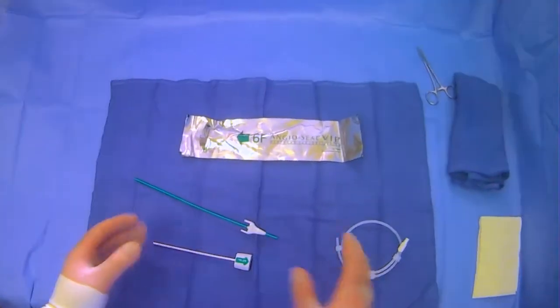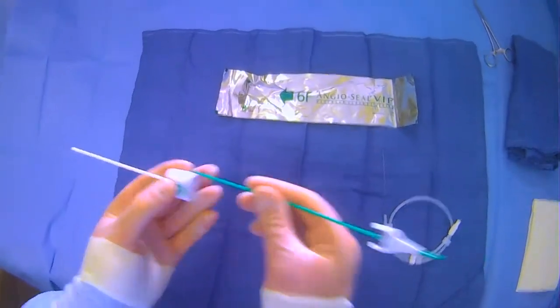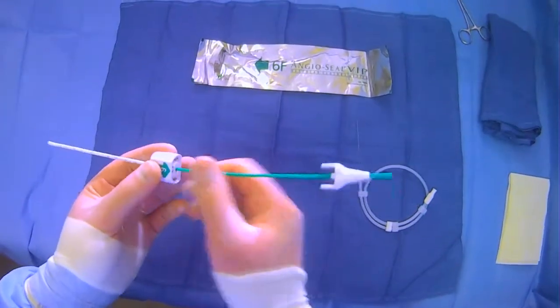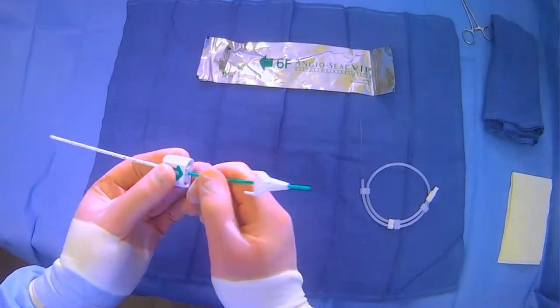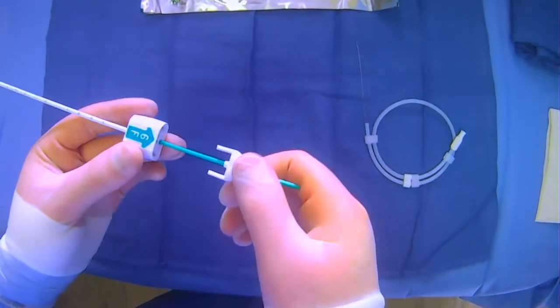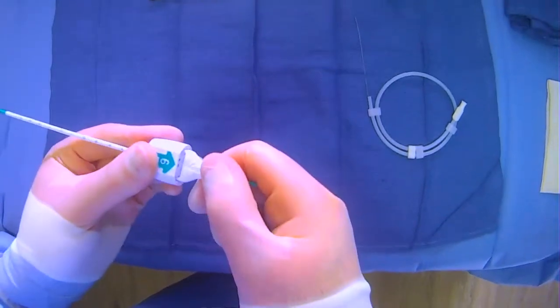To go through how everything works, one of the first things you do is assemble the introducer. You put the inner stylet into the introducer. There's an arrow here and an arrow here — it will just click into place, and you can hear that little click.